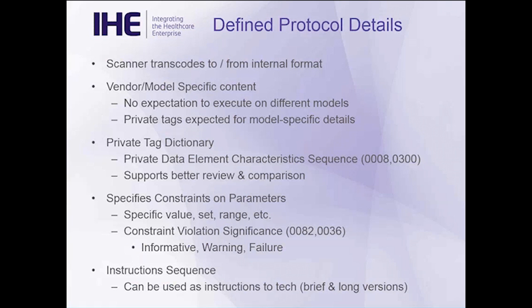So we do not have an expectation that you'll be able to take one protocol and run it on 3 different vendor scanners, simply because the engineering is different, the design is different, the operational envelope for the systems is different. So these are intended to be for very specific models, which is another reason why it's necessary to have a system for managing the large collection.